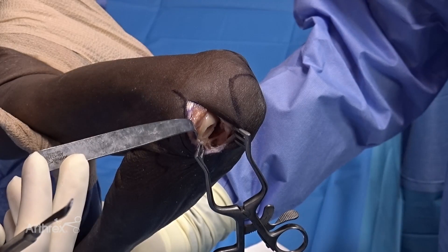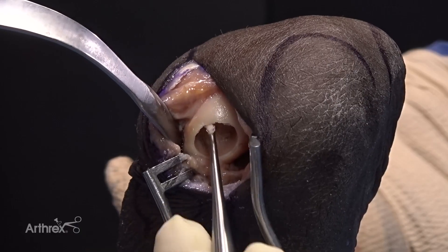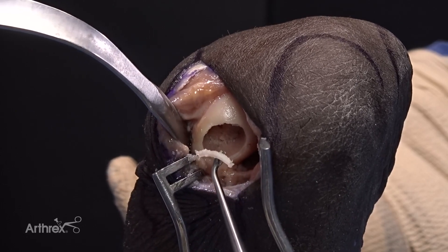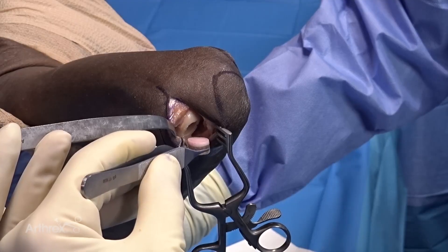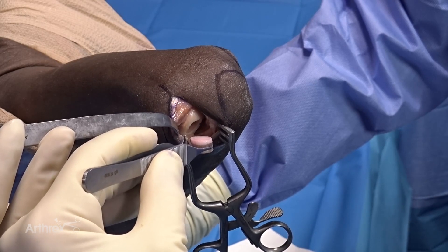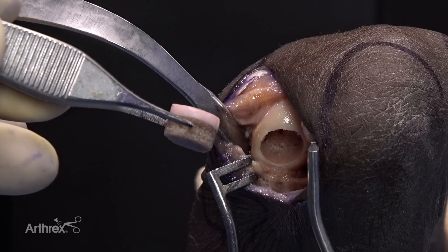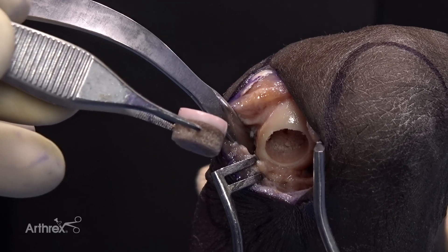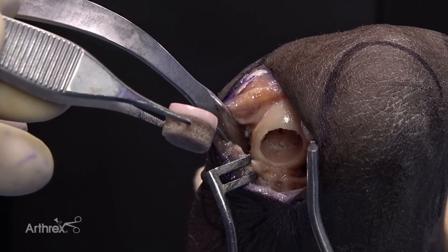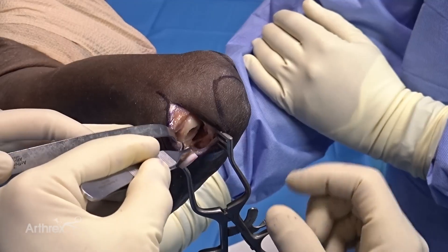We can check the recipient site for any remaining bone debris or chondral flaps as shown here. After completing the recipient site preparation, we've measured and cut the graft to the appropriate length. We've lavaged the graft to remove any remaining cellular elements, and we use a small rongeur to bevel the leading edge of the bony portion of the graft to aid graft insertion.